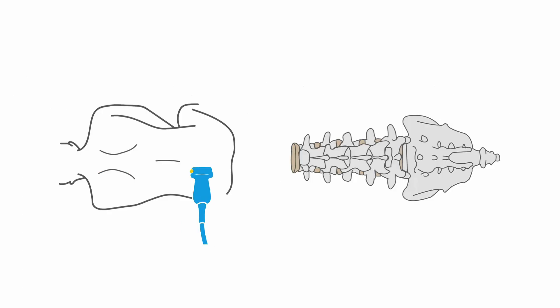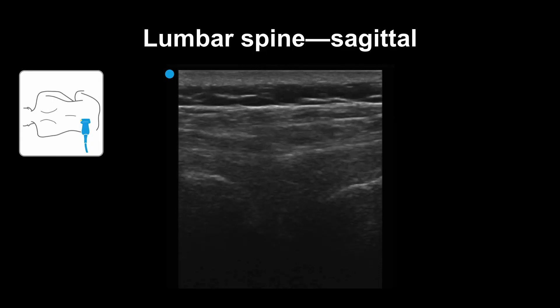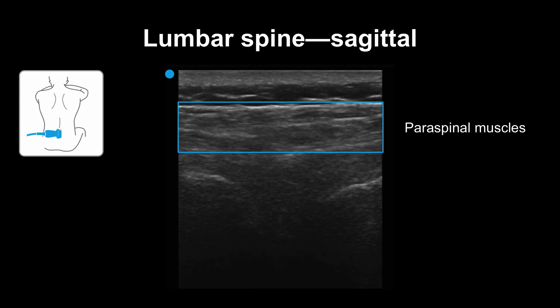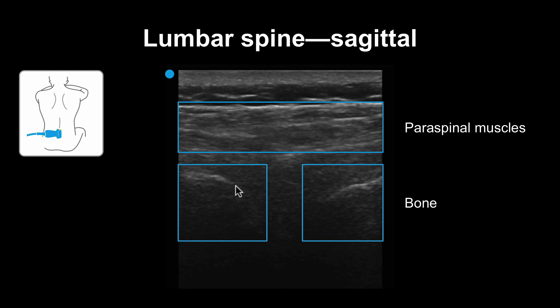Now let's take a look at the spine in the sagittal plane. This is a view of the sagittal lumbar spine with the hyperechoic spinal structures. You can see the paraspinal muscles, which appear striated or striped, and the hyperechoic bony structures with the corresponding shadowing down. You can see that this view looks the same whether the patient was lying down or sitting up.